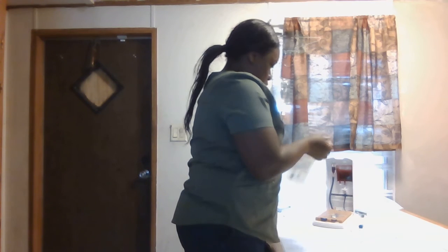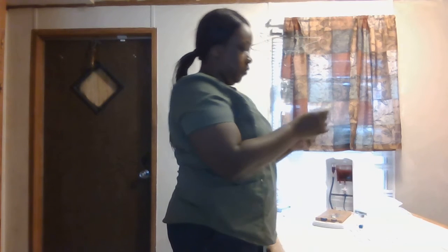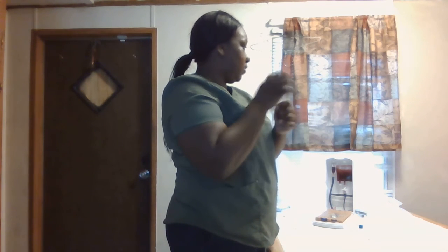I'll get my trash out the way. Trash can. Again, we're gonna look at it, make sure it's not expired, give it a little squeeze to make sure it doesn't have a hole in it.